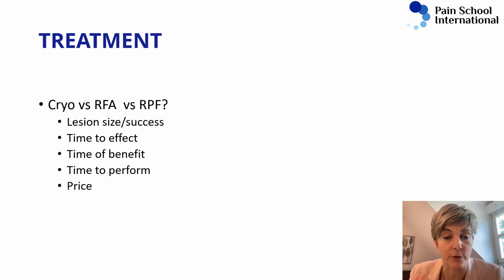So we can do pulse radiofrequency or cryo. A pulse radiofrequency is a harmless thing to try. Maybe it works fantastic. However, if the results are too short-term, then you can consider cryoablation. It's a big lesion. You can rehab a patient. This is, again, a 16-year-old. So even if she has an instability that leads to entrapment now, that probably will recover with time. And in this case, time to perform the procedure is the same as with radiofrequency.